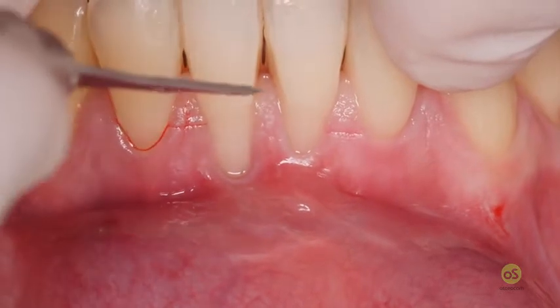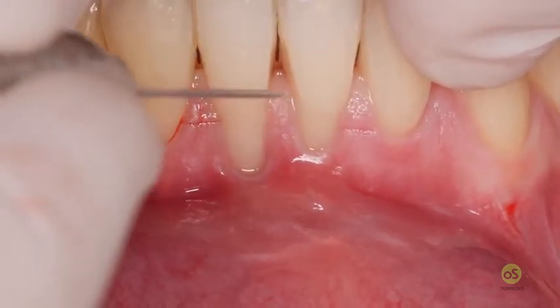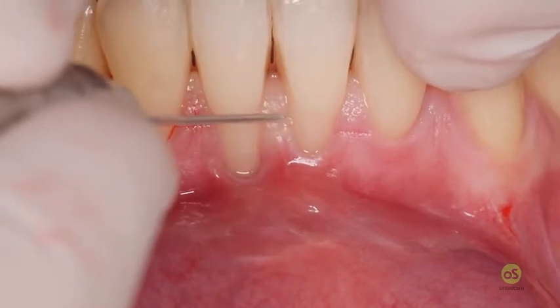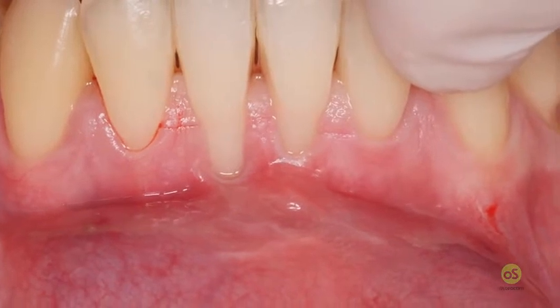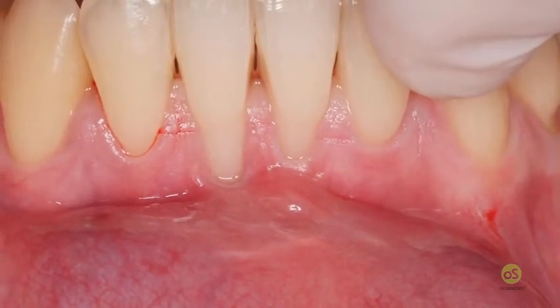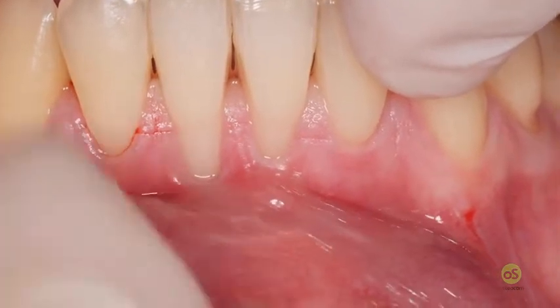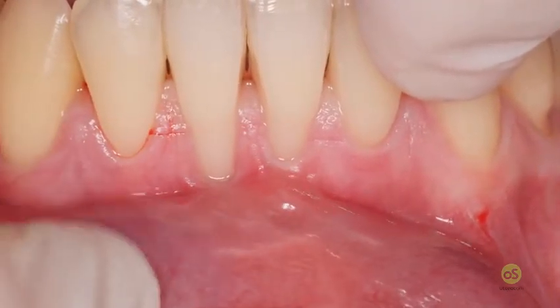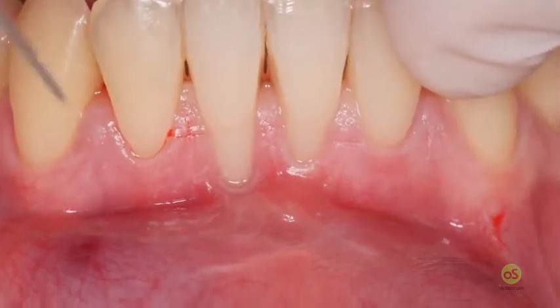And the most difficult of all is here, because here there is alveolar mucosa. So I want to shift the keratinized tissue as coronal as possible, in order to take as much keratinized tissue as possible in my surgical papilla. So first difference, the incision line must be placed where you have the best quality of keratinized tissue.